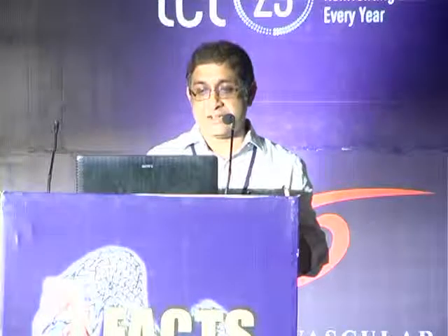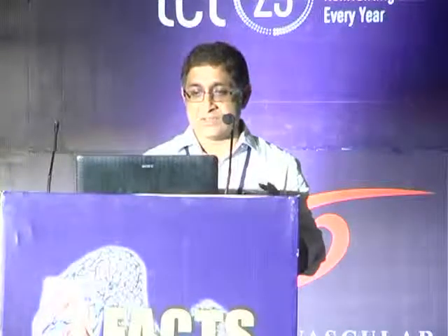I'm sure I need to post-dilate this stent, but look at what is happening. The stent doesn't want to go across the bend, and this stent I have deployed at 16 atmospheres, but still it doesn't want to go. I know that there is under-deployment in the middle of the stent, and it is only after I have deeply intubated the guide catheter into the stent.